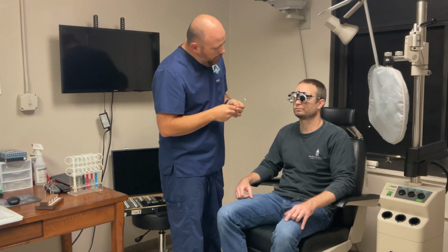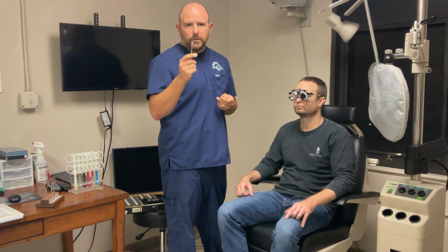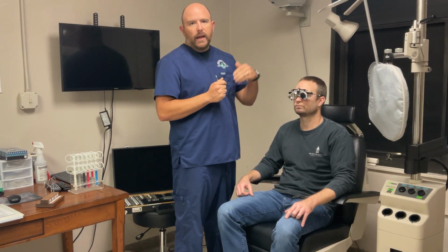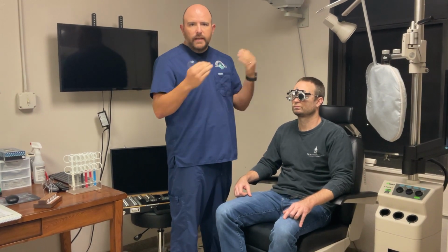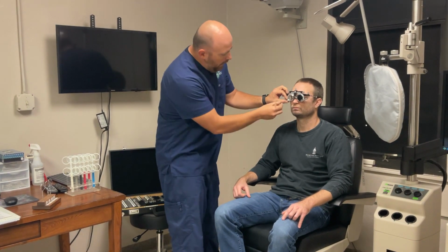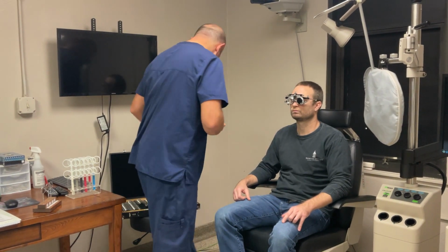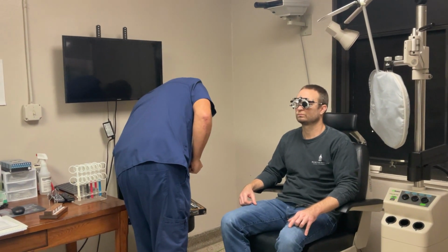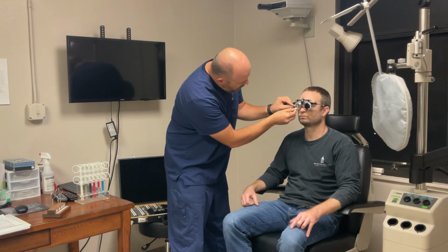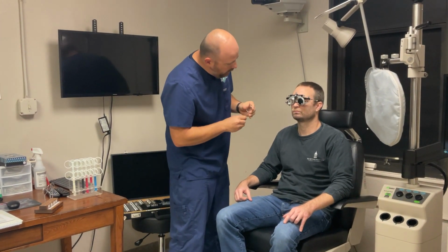So he noted neutrality. If I take the lens out completely, then effectively I'm rotating around plano with my cylindrical lens. So I don't want to remove the -0.5, but instead what I want to do is go back up to -1.25 and see if he takes me back to -0.50. Because in that case, we can't kind of go on the floor, but we can effectively bracket up higher. So let me remove this lens here. Grab the 1.25 again. And again, I push the handle of the lens all the way to that stop. It makes it real easy to find.